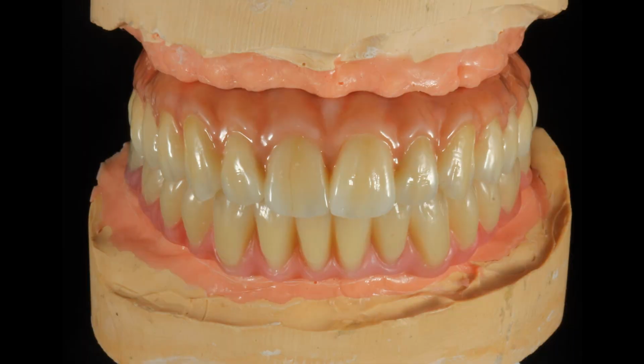Because this patient was a grinder, severe grinder, maybe the worst I've ever treated, he was getting upper zirconium. And I don't like to do upper and lower zirconium in somebody who clenches or grinds at all, but especially a patient like this. So what you see here is the upper final restoration in zirconium, characterized in the appropriate color, that which the patient and his family and I picked. And the lower is now the same wax prototype with slightly different teeth to deliver the upper and then get ready for a different type of lower.